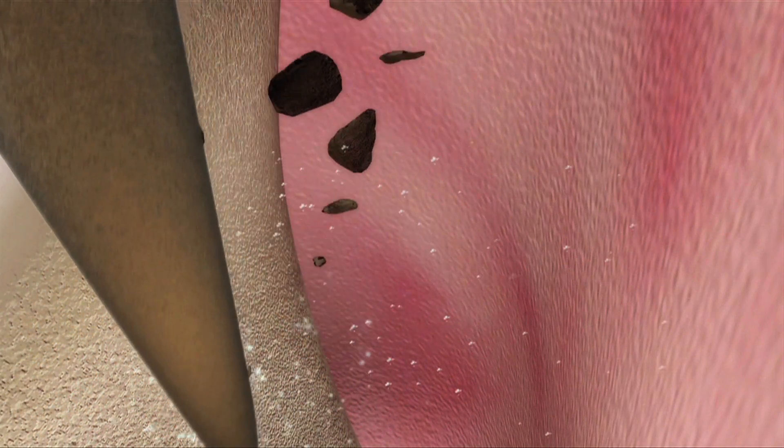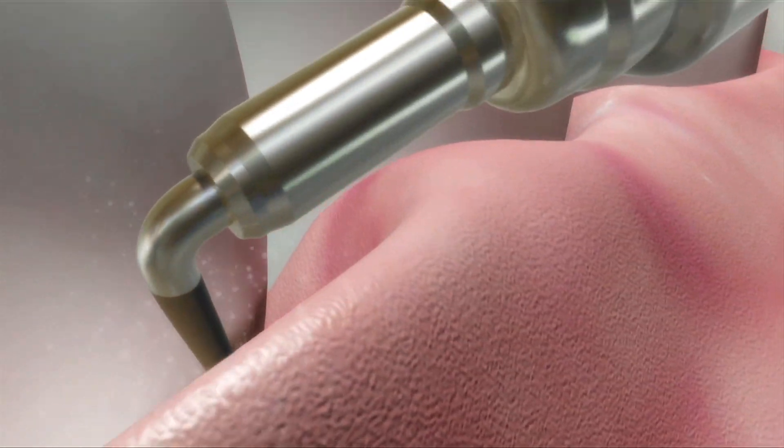Now we go back over the root surface very lightly with a piezo scaler, using a side-to-side motion from the top to the bottom of the pocket, just to confirm all the calculus is removed. Thorough removal of the calculus is crucial to good healing results.